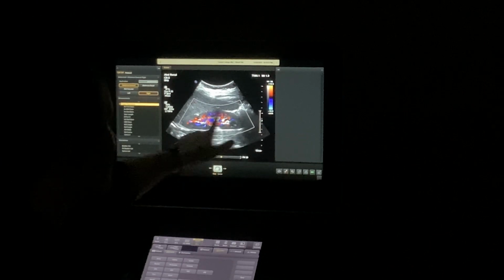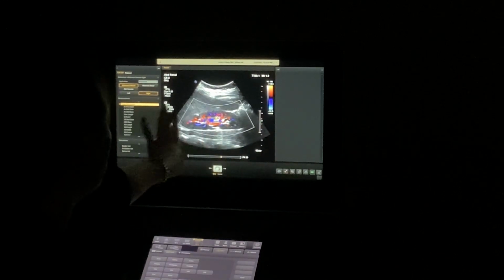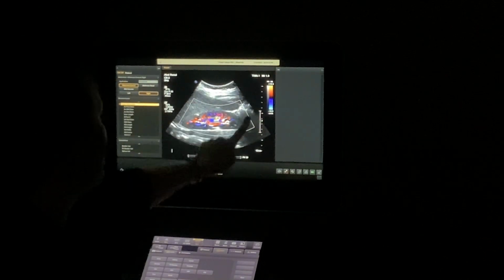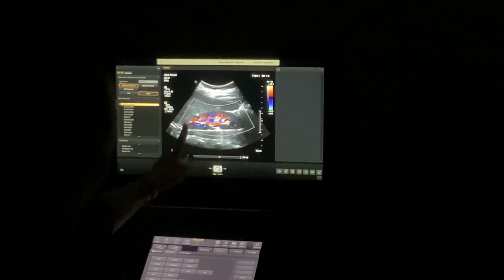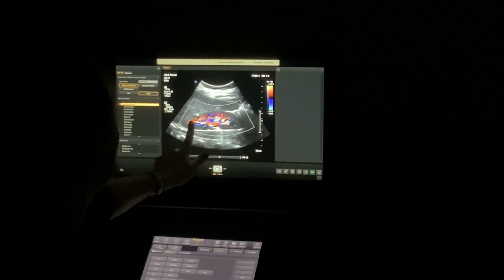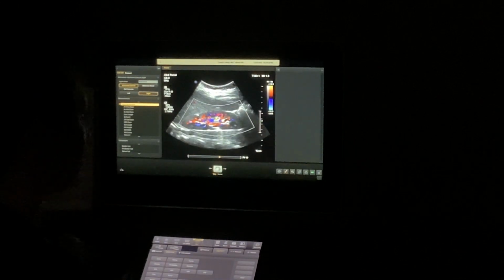You see how I have pretty much that mid image again? And then I've got the box big enough to just cover my kidney. I don't want to see just this part, just that part, cutting off the edges, squinched up right next to it. Show me a box that my kidney can fit in. Put the kidney in a box. Make it fit, okay? So when we talk about perfusion and getting up into all of these parts of the kidney from the hilum, that's what we're showing here. Do y'all see how that goes all the way through and shows me color all through the sinus and all into the cortex? That's what your color picture needs to look like on mid, okay?